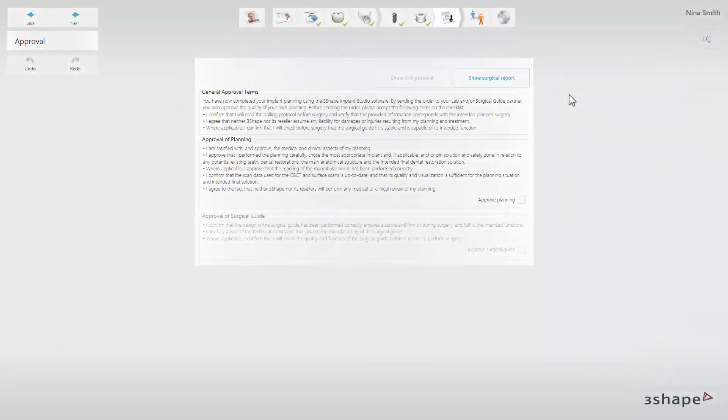In this video we will show you how to approve a case, send it through 3Shape Communicate to your partner and save a completed case in Implant Studio.